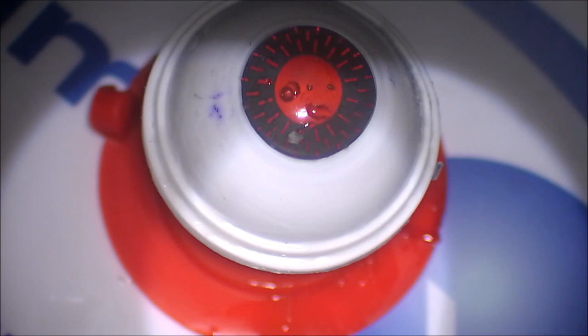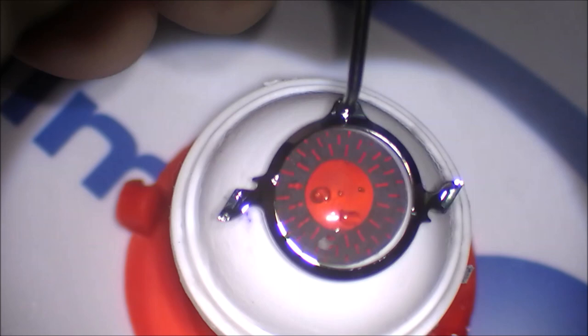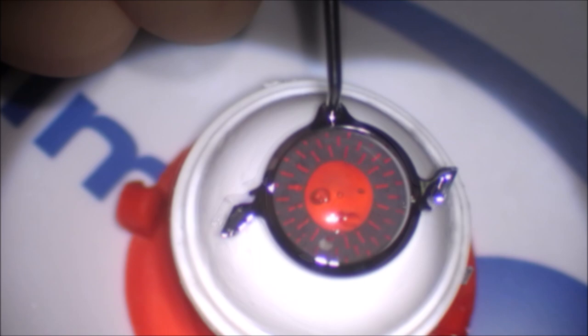Now I'm placing the Yamani Double Needle Stabilizer on the Model Eye. And here I'm just adjusting myself. You see that I had my marks there, but I don't need those marks since I have the hash marks on the actual device.